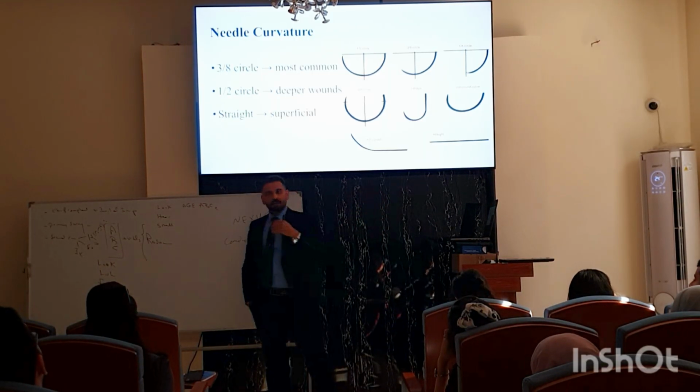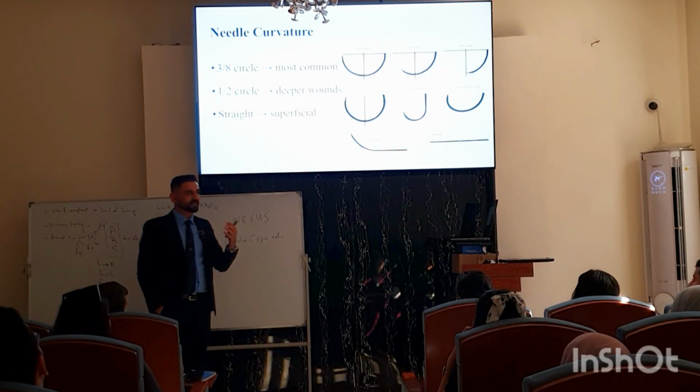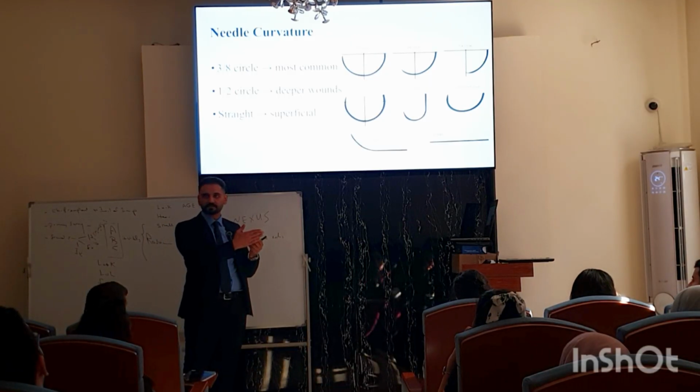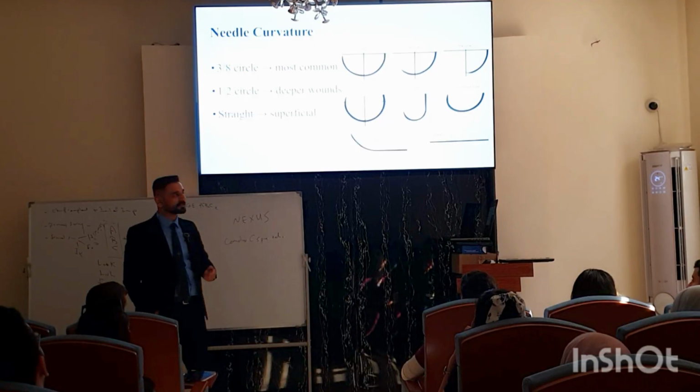Is that clear? The more superficial, the less curve we need. Even a straight needle will be useful for superficial and very superficial things, because you can just pass the needle straight forward and take it from the other side because you are controlling it well. It's not that deep.